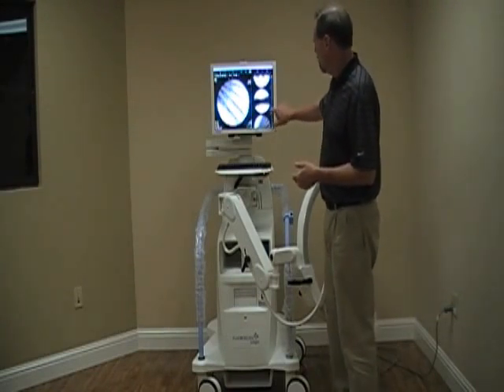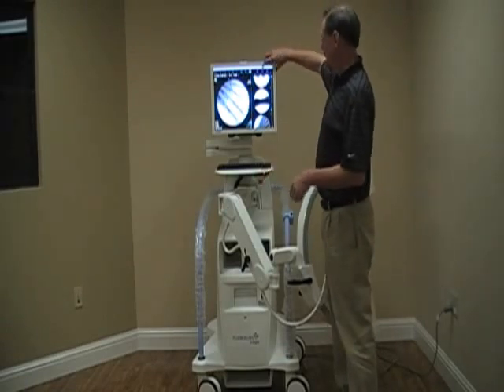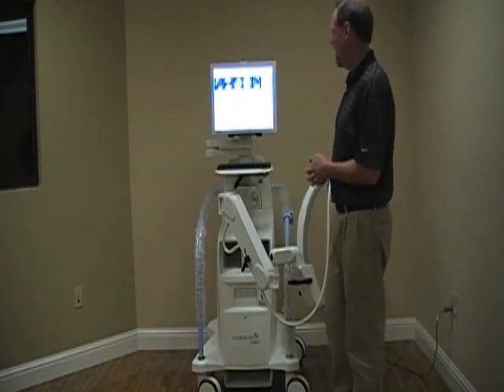Most of the time, I'll suggest that the physician prints the images after the case. So to do that, we hit Review. It's going to bring up all the pictures we've taken during the case.